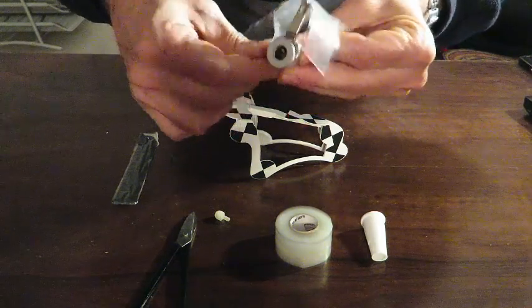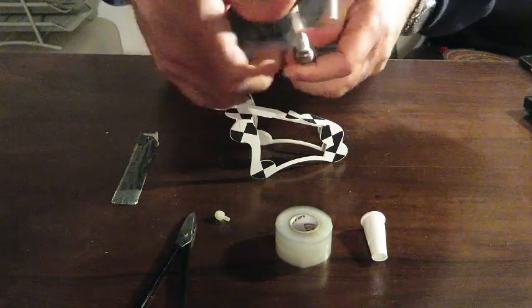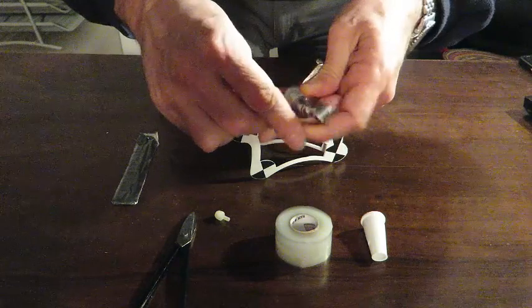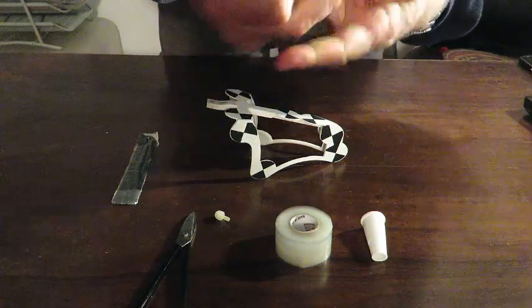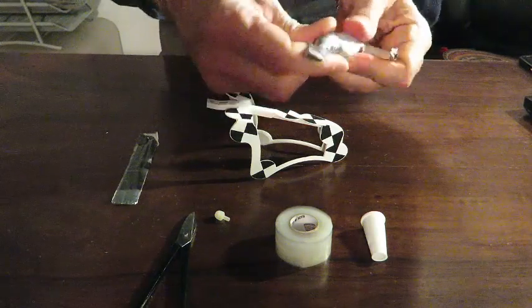Once we have done a full circle, we need to start stressing the silicone. We just pull the silicone and we will see that it turns milky in color. Then we pull it out and keep twisting the silicone on top of the adapter.